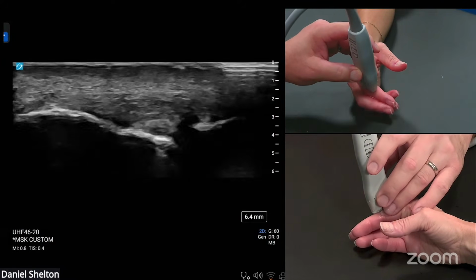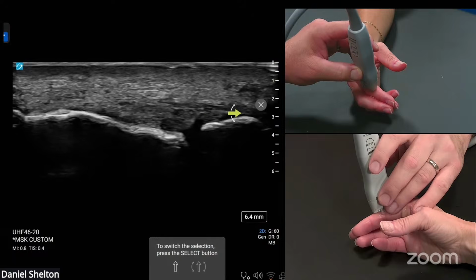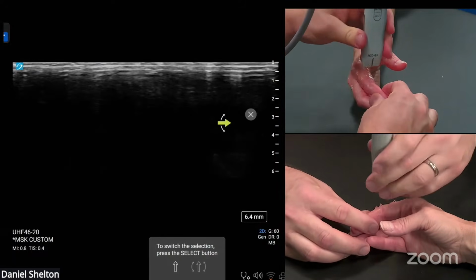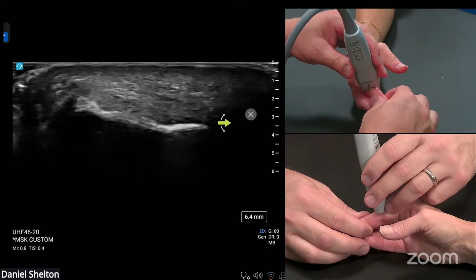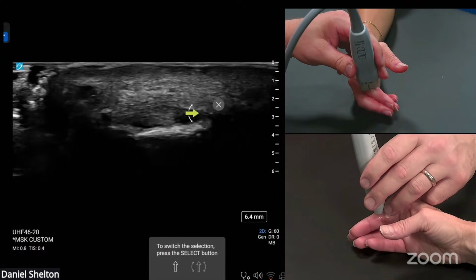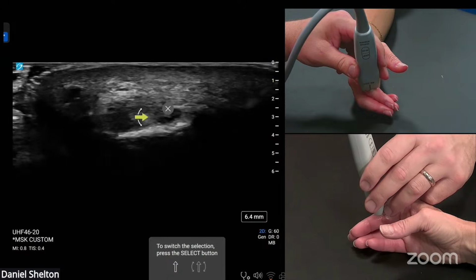So we see the same thing. We see actual fibers because of the resolution of this transducer, but we can see these ligament fibers of the primary. And we'll rotate the probe almost in a complete short axis to see the accessory. So left side of the screen would be dorsal there. And there I can see the shadow starting to form of accessory right there. But the accessory origin being here up top. And this would be the primary going cross-sectionally across the joint.